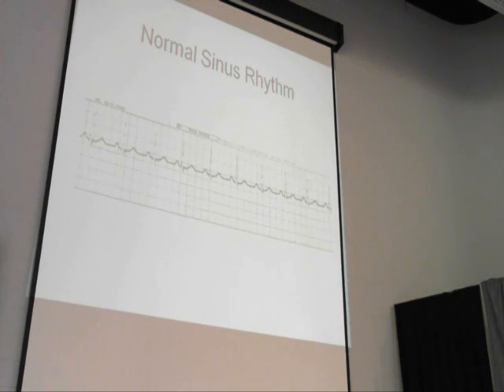So in the Mr. Rogers world of cardiovascular activity, we have one P for every QRS. That's what we need to get a rate. We want an atrial and a ventricular rate. And normal is what as far as the rate? Normal is between 60 and 100, that's correct, and there's one P for every QRS. A P, QRS, and a T is one heartbeat, one cardiac cycle, and that's what we want to maintain. We want to recognize it. And the P waves, are they regular?